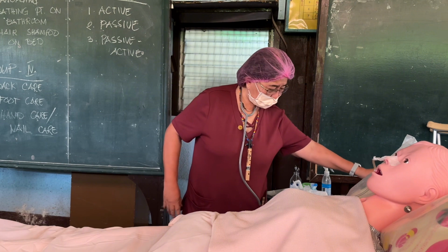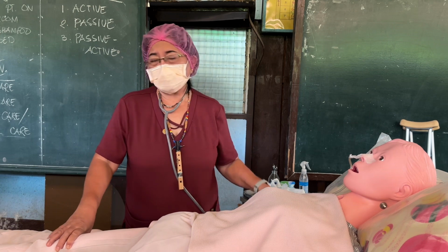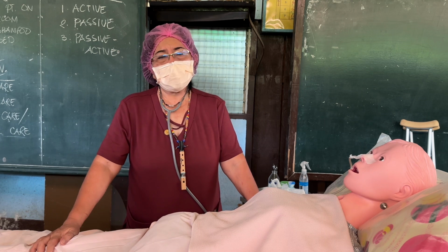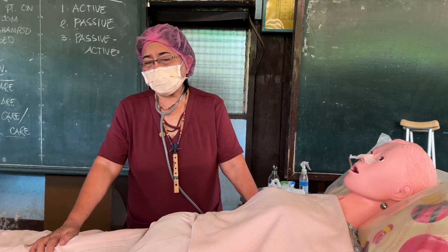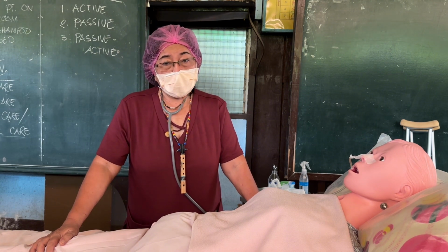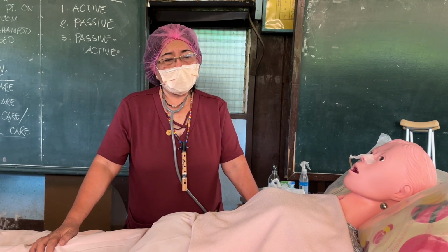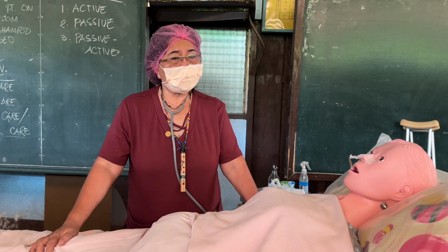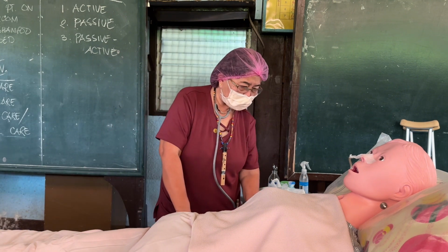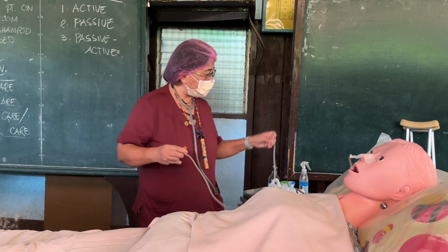Another case: abdominal surgery with massive bleeding. The doctor post-operatively ordered us to flush and irrigate the abdominal contents of the patient. For what purpose? In order for us to know if there's bleeding in the abdominal cavity, to assess what other particles or contents are inside the stomach, and also to clean the inside of the abdomen. Now, this is no longer gravity drainage.